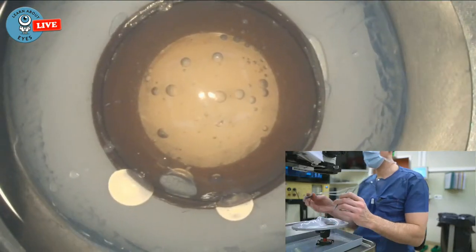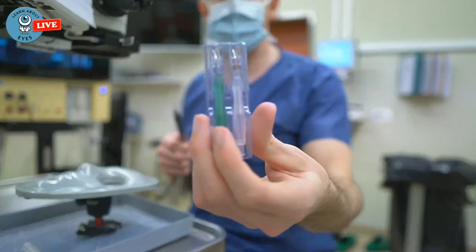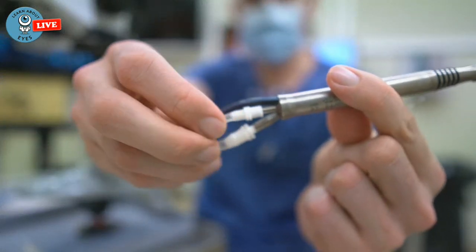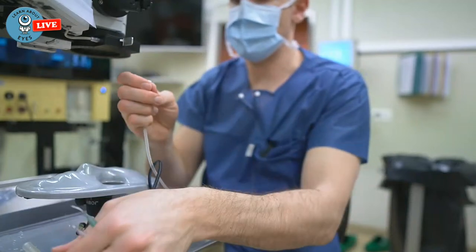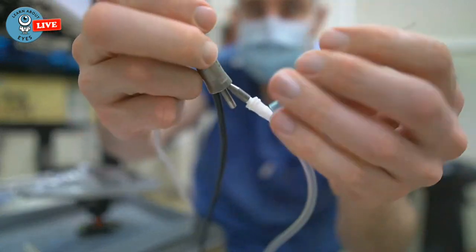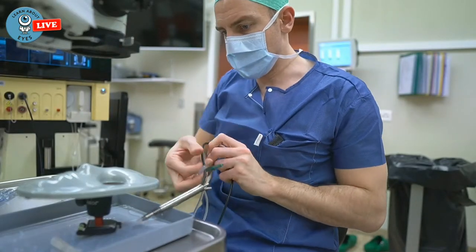Unfortunately, with these eyes, you don't really get any cortex that you can take out, but you can still practice that. So to take out the cortex, we use a bimanual irrigation aspiration system, and you just take these things off. Attention, it's usually getting wet after this. And then just put it onto the part that actually fits. There we go. Now this one is going to spill. And now we have these two. Put that phaco tip somewhere safe.